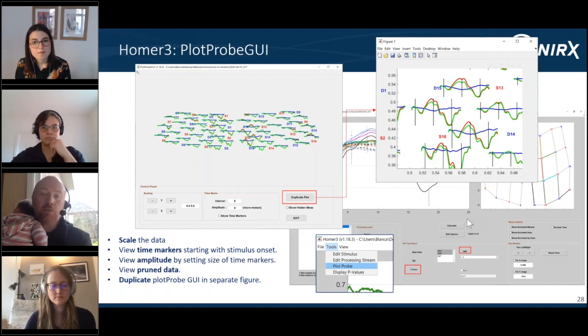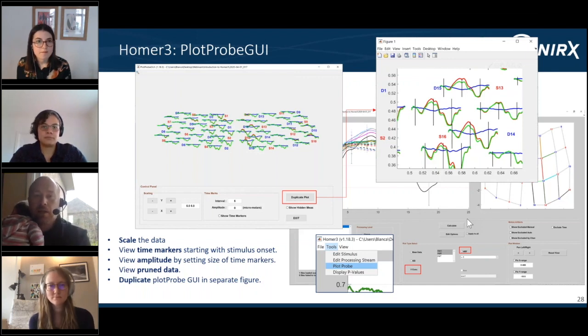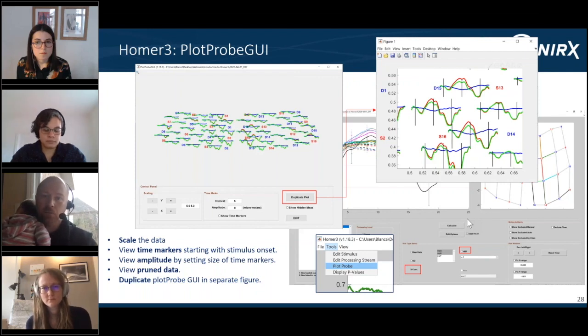And the realization was that it wasn't even that they weren't in the package; it was the way the infrastructure was set up made it really hard to do some of those things. So in writing the toolbox, we started at the other end: now that I have colleagues that want a mixed effects GLM model treating age as a covariate of no interest, how do you actually propagate your NIRS data through to answer that question? We worked backwards, getting the stats right and then working back to the pre-processing steps. So my toolbox is very heavy in the statistics, particularly at the group level.